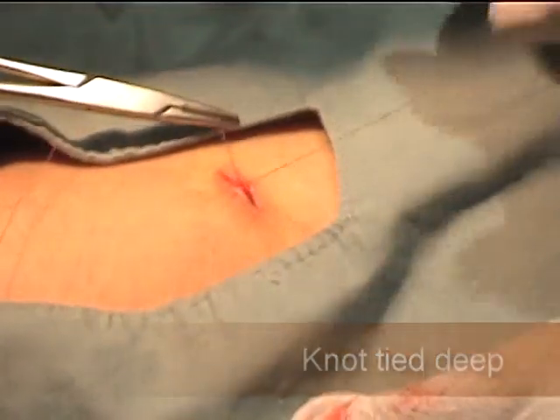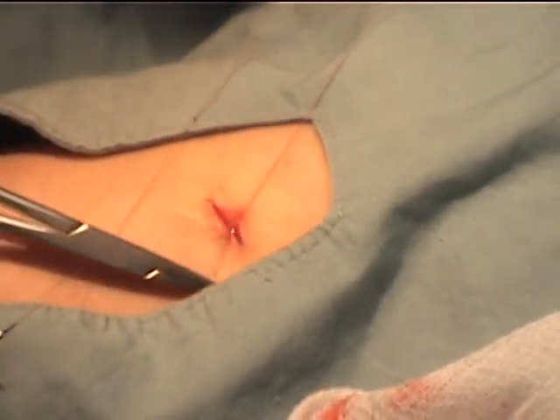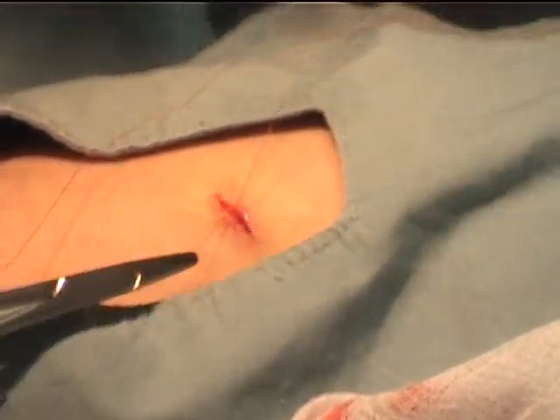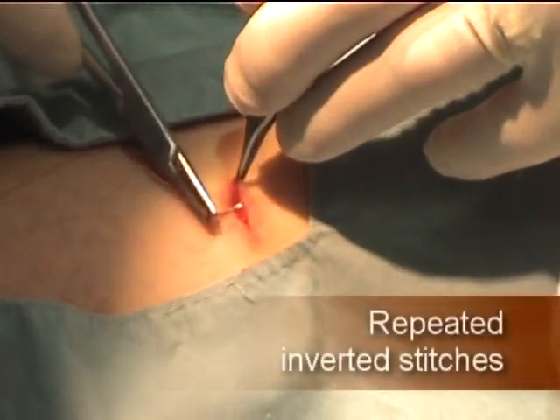Once that is done, tie the knot. During the tightening of the knot, pull the wound together with the knot lying deep to the subcuticular layers that are brought together by the stitch. Cut the suture short and apply the next stitch elsewhere in the wound to bring about further closure of the wound.